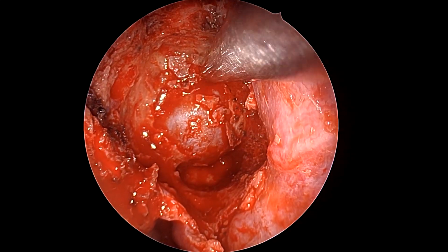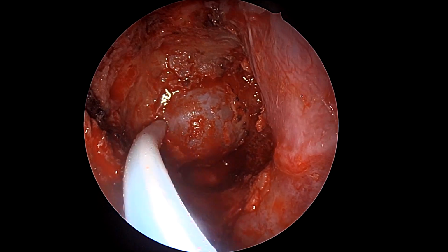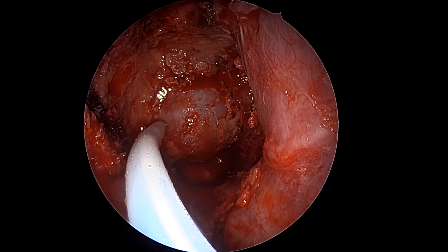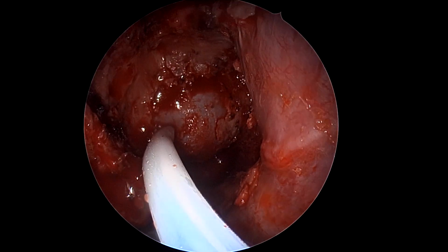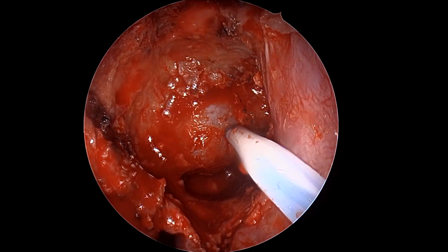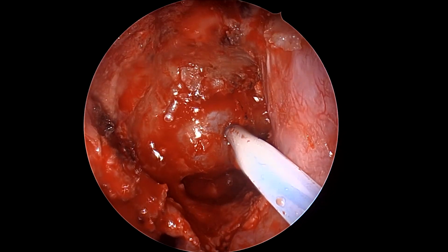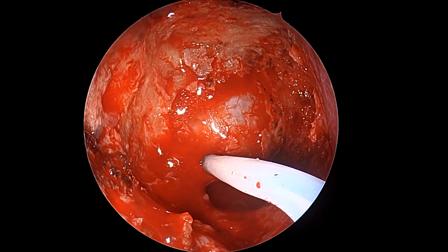As you can see, we have been removing some of the bone. We again, since I said now this is a Doppler probe, trying to figure out the approximate location of the vessel as to how lateral that would be, because that would also dictate how and where we place our incisions onto the sellar walls.